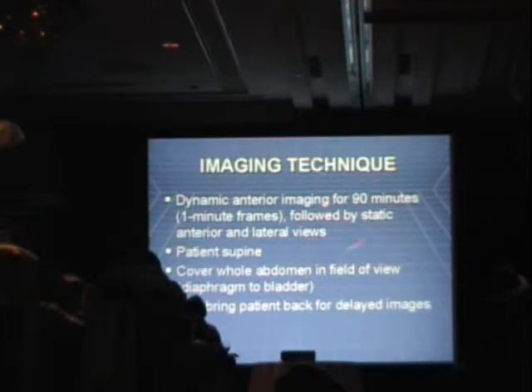We imaged in the anterior view for now maybe 60 minutes. We never found very much happening in the period between 60 and 90 minutes. So sometimes we bring them down for delayed images, but standard is now 60 minutes for us.